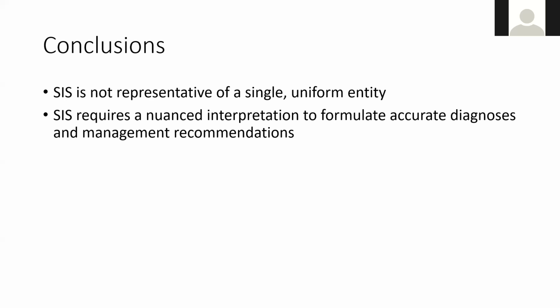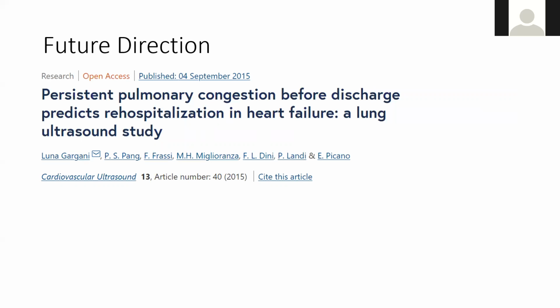So in conclusion, hopefully what you have learned or seen illustrated by our cases today is that sonographic interstitial syndrome is not a single uniform entity. It requires a nuanced approach and interpretation to formulate an accurate diagnosis and management recommendations. In terms of the utility of lung ultrasound, though, I think the fact that we are starting to figure out these nuances is extremely helpful, and it will improve our inpatient as well as outpatient management.